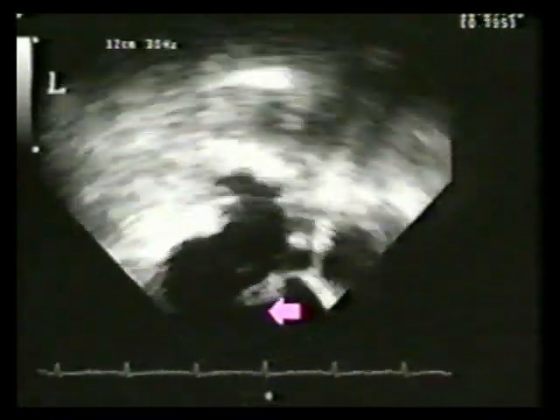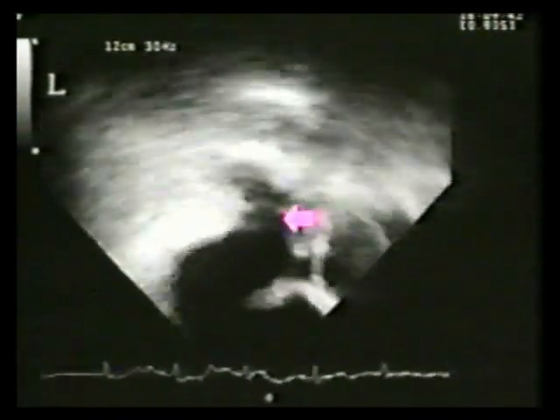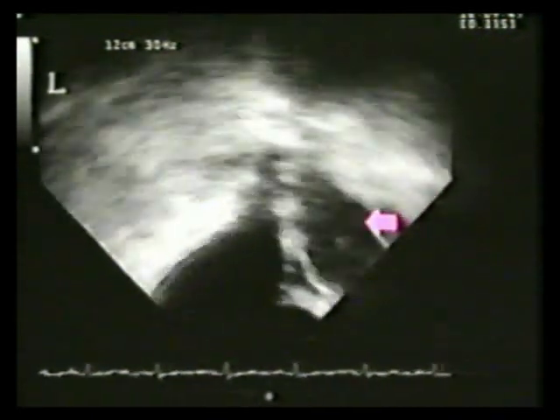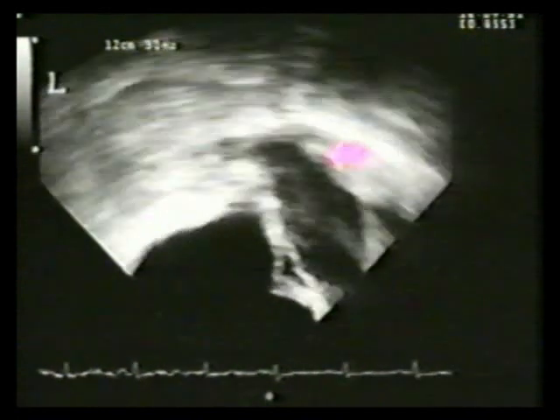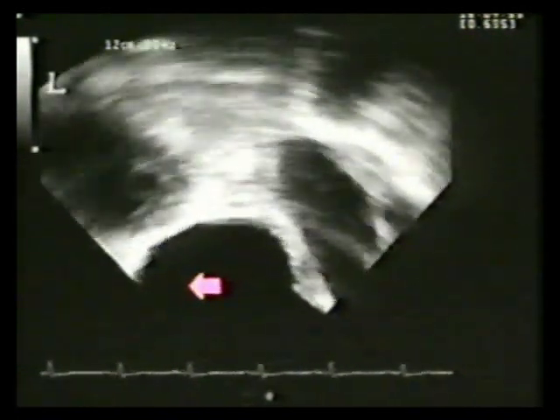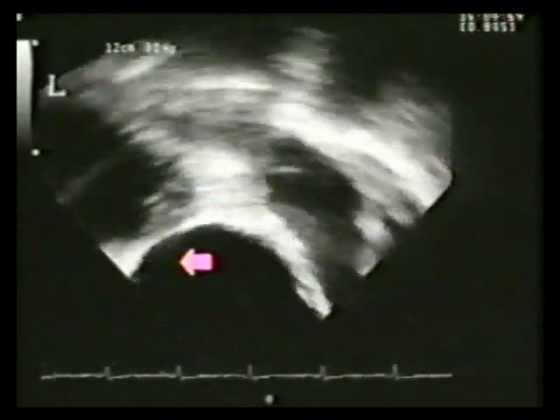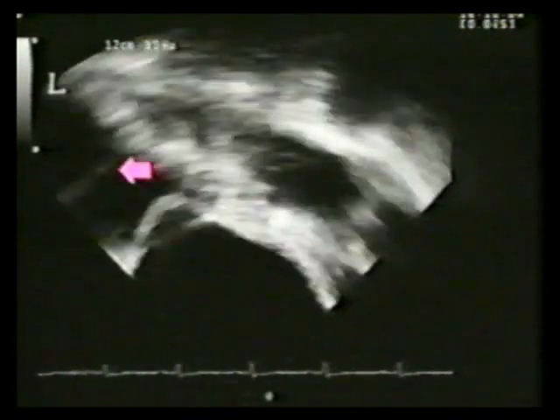As the scan is rotated progressively rightward, the partition between atrial appendage and superior pulmonary vein are visualized. The left pulmonary artery is visualized superior to the atrial appendage. This progressively turns into the main pulmonary artery. The transducer posteriorly is adjacent to the left atrium. At the apex of left atrium is the mitral valve, which in this patient is stenotic.